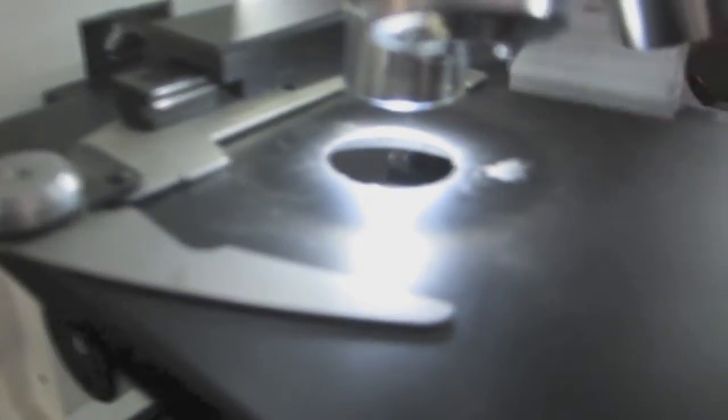And then a drop of the diluted blood sample is placed on the counting chamber of the hemocytometer and a cover slip is placed over it. The hemocytometer is placed under a microscope and the cells are focused using various magnifications.